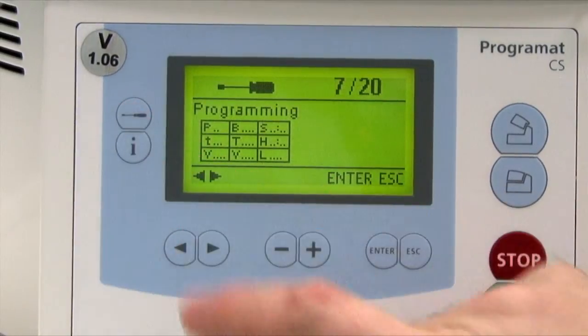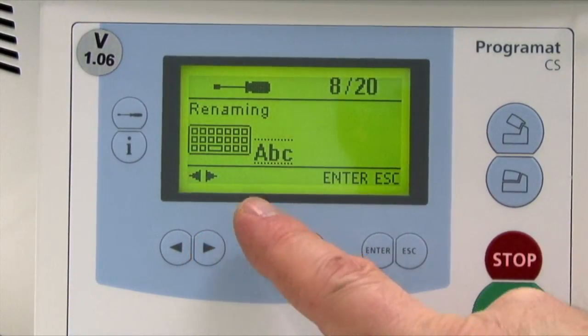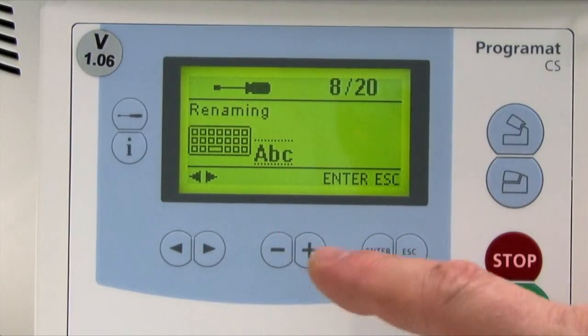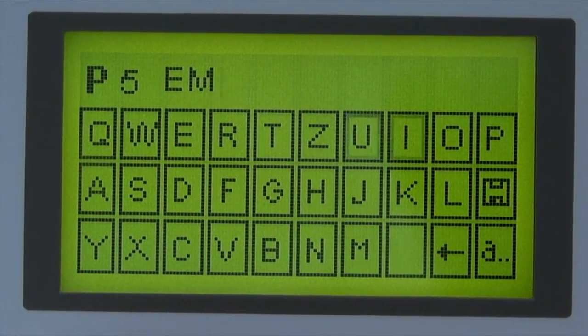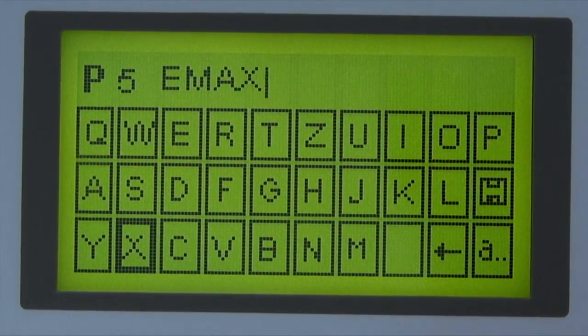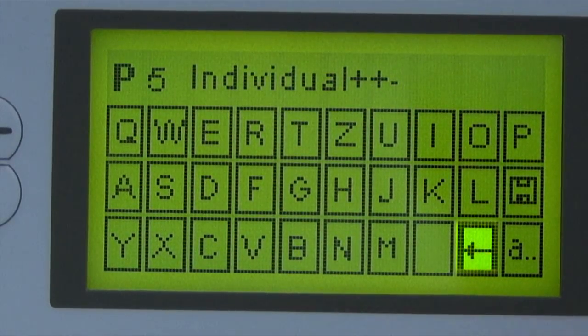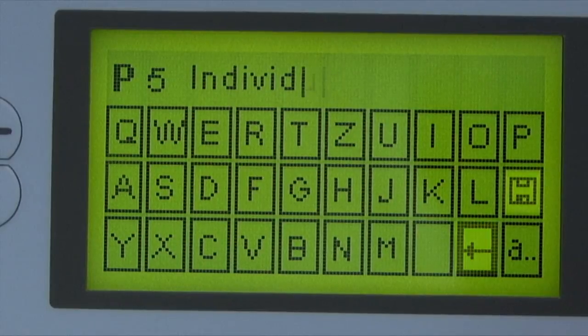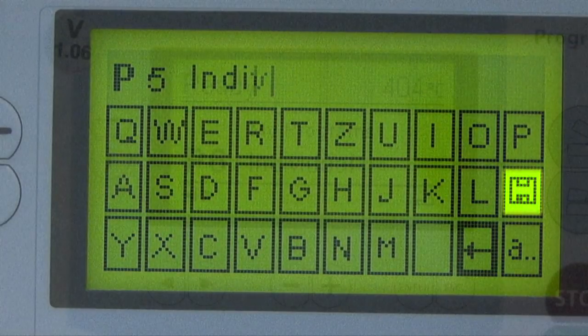To rename an individual program, the keyboard can be selected via the settings renaming option, provided the selected program is not write protected. Note that there are two renaming settings: the first is the lower line and the second is the upper. The desired letters can be entered using the cursor keys and then selected by pressing Enter. Individual letters can be deleted by selecting the arrow key, and changes are saved by the disk symbol, which also exits the keyboard display.